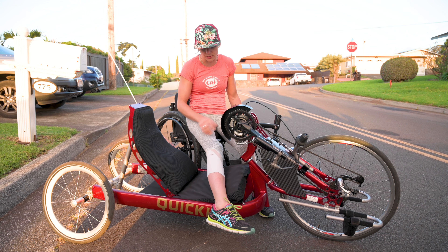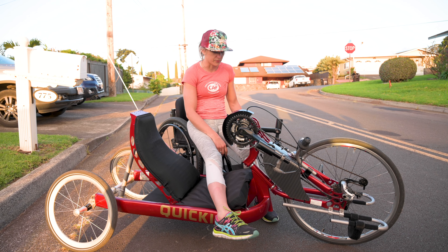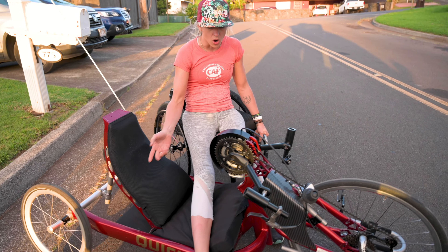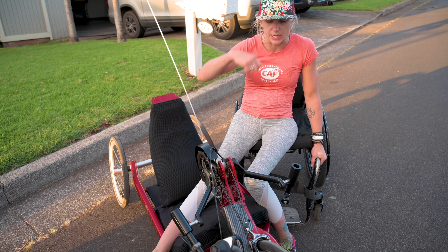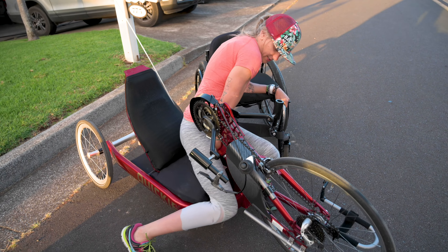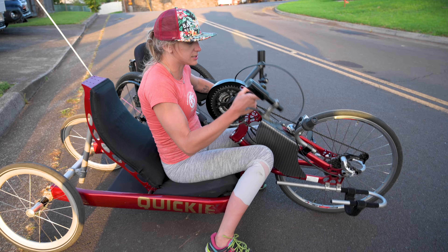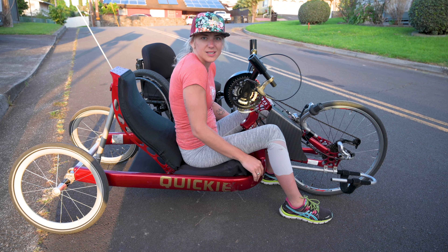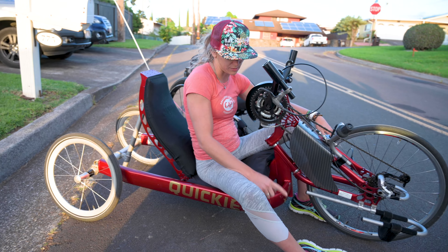Transfer videos — so my spasticity and the way everything works, I don't know if anybody does like the two legs on one side, but I like to throw one over. Especially getting on the bike, then you don't have to flip your knee up to your face. I'm able to slide myself a little bit more gracefully into the seat. Flip that up — down's easy, just toss your feet into the pegs.